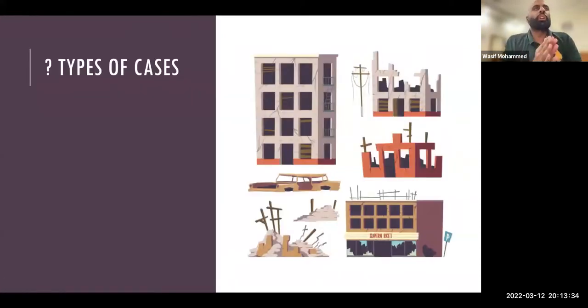So what is the content of the cases? We know what sort of cases we'll get for rapid reporting. They'll have a clean single abnormality, which will be very evident. I think even in the Viva, the cases will be very similar. You'll have a single abnormality. You won't have unnecessary images in the stack of CT cases, so you won't have to scroll unnecessarily. As soon as you start scrolling, you'll see the abnormality.